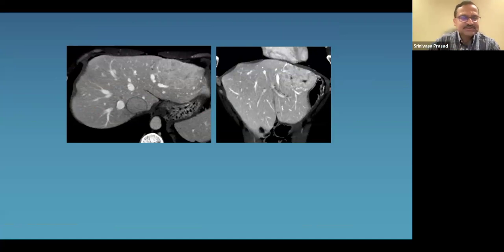It's very difficult to see even some of the large tumors, particularly if we are scanning too many patients and looking at too many scans a day, if we don't get the timing of the scanning right.